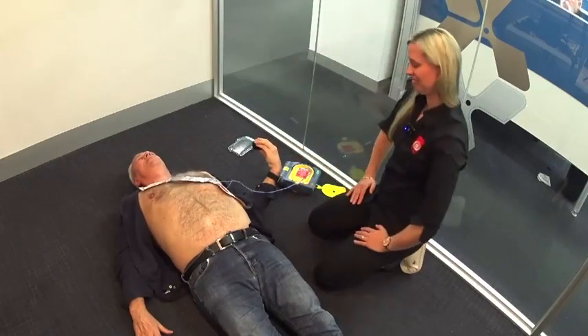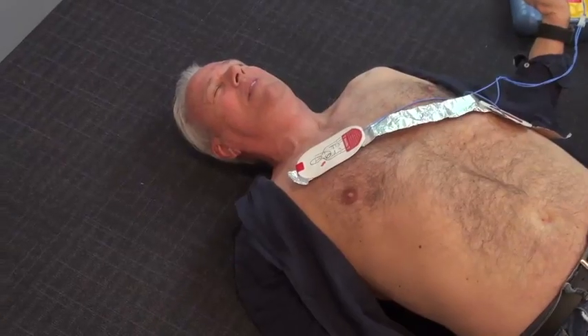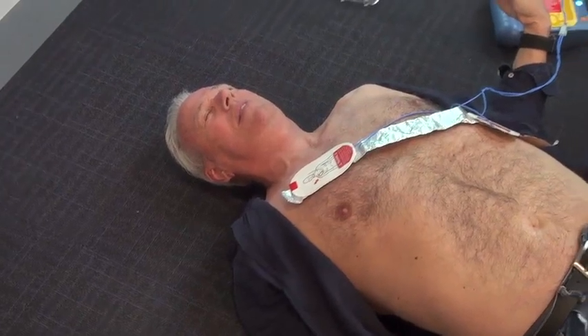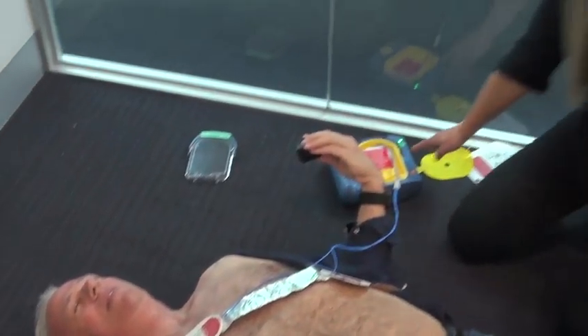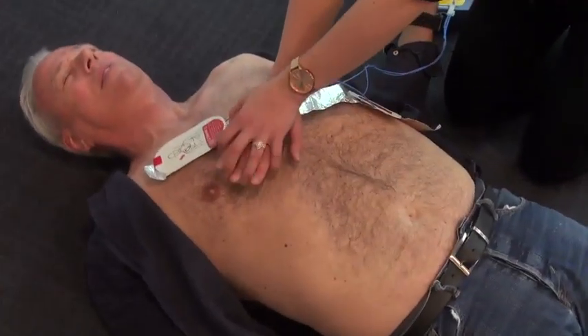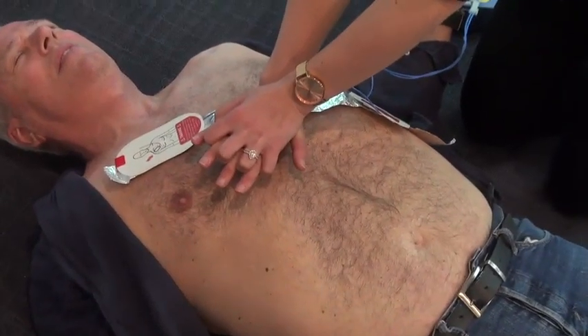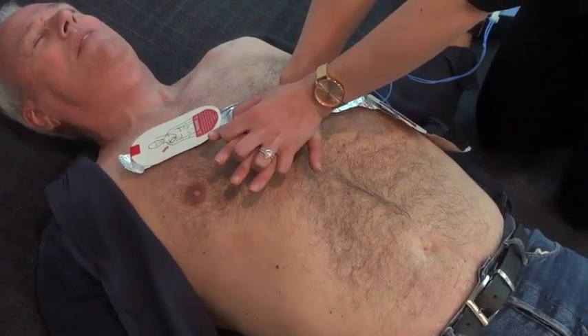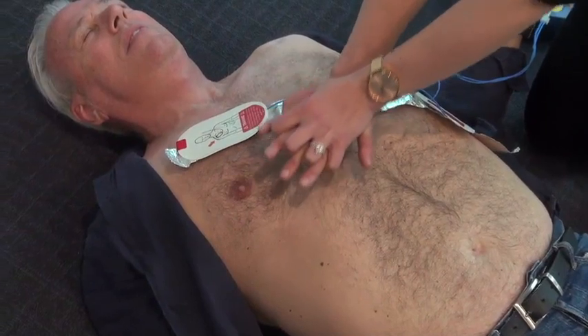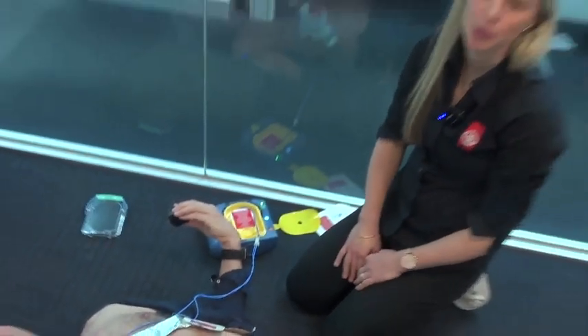Be sure the ambulance service has been called — we did that. It is safe to touch the patient. Start CPR. For help with CPR, press the flashing blue button. Place the heel of one hand in the center of the chest between the nipples. Place your other hand on top of the first. Push the chest down firmly five centimetres. Keep time with the beat — and we'd follow those instructions to do good CPR on the person who needs it.